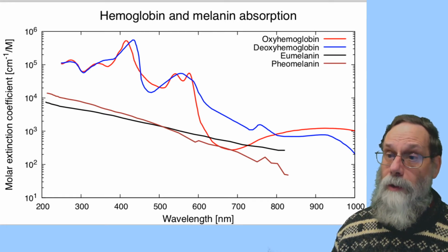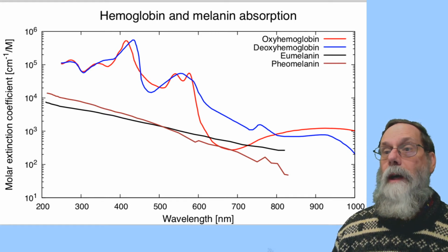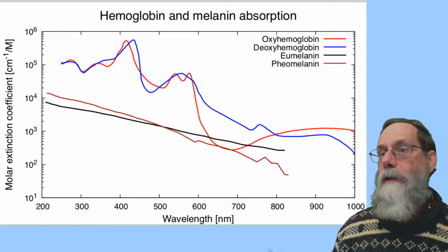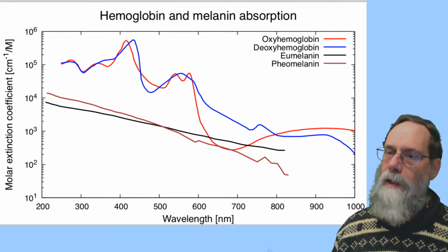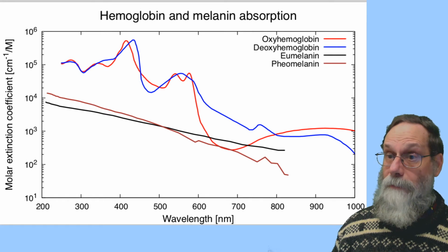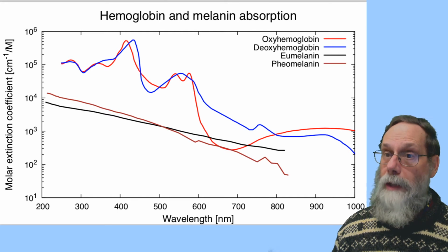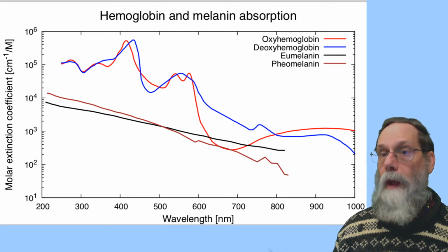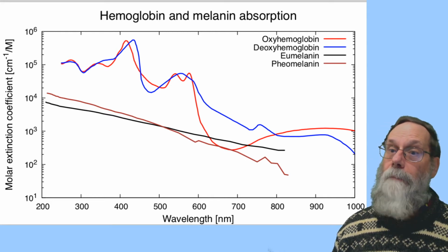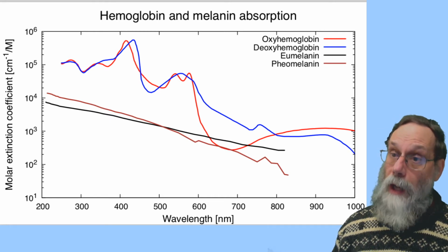And what the pulse oximeter relies on is the fact that oxyhemoglobin and deoxyhemoglobin have different absorption curves. If we take a look at around 940 nanometers here, that's in the infrared, that's where silicon photocells and stuff are most sensitive. In that region, oxyhemoglobin absorbs a bit more light than deoxyhemoglobin does. However, if you look at around 680 nanometers, you can see that the deoxyhemoglobin absorbs much more than the oxyhemoglobin.